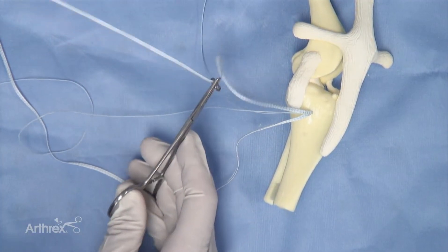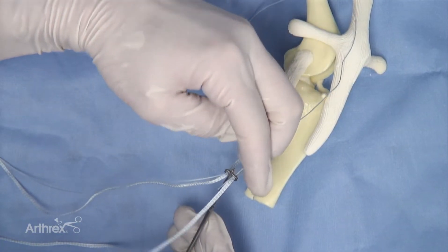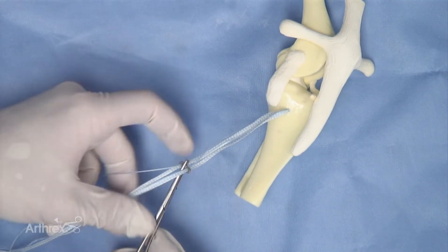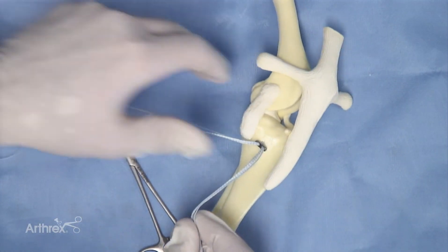The fiber tape is inserted through the two-hole button, followed by the fiber wire. Making sure these strands are well organized and not obstructed is advisable. The two-hole button is then placed down to the bone surface.